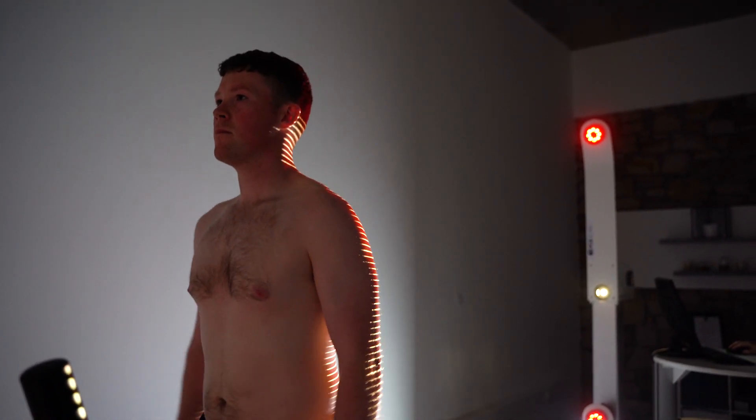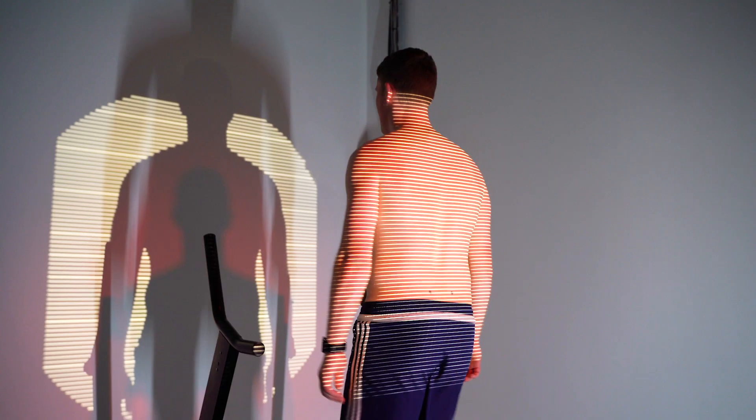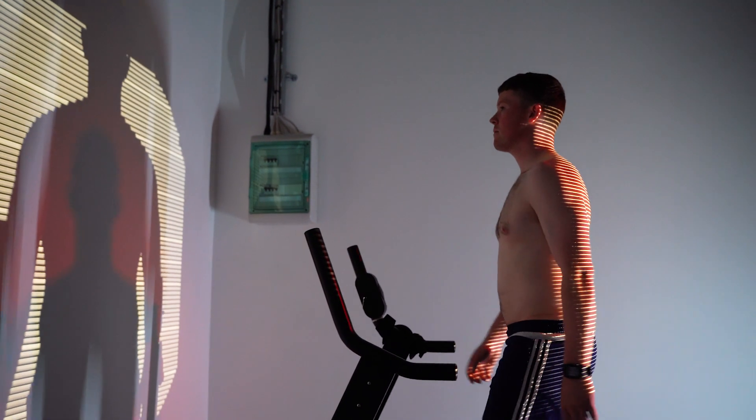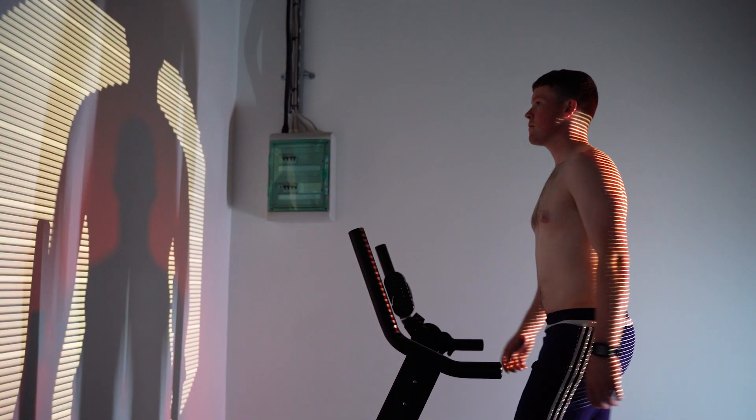They have often had previous therapy or treatment with varying degrees of short term improvement. FCE scan however seeks the true and underlying musculoskeletal cause with a view to long term improvement.